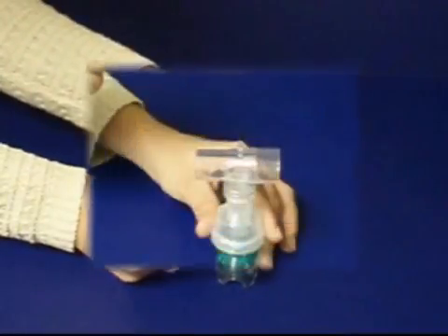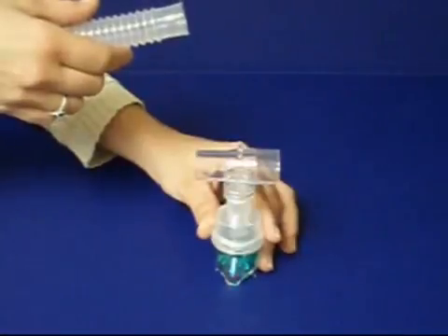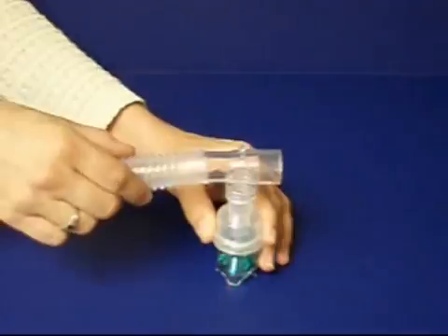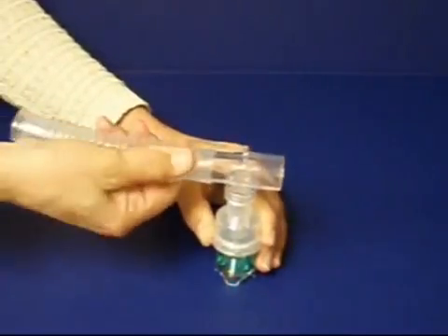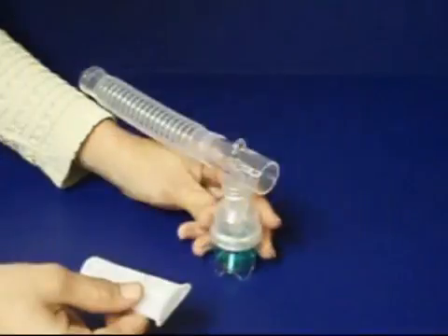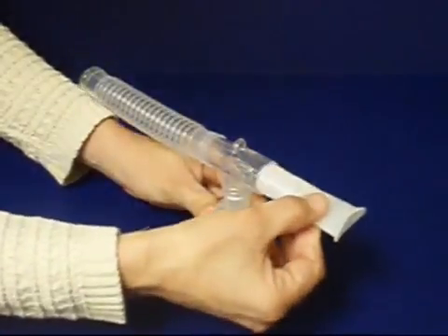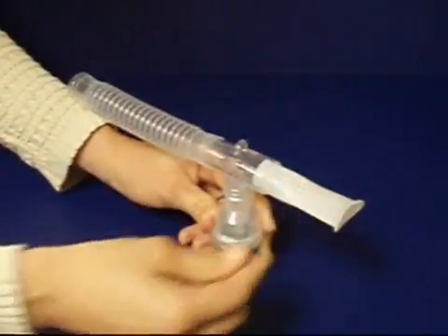Connect one end of the 6-inch corrugated tube over the smaller diameter end of the T adapter. This tube stores excess aerosolized medication between inhalations to minimize medication waste and to improve the effectiveness of your treatment. Place the round end of the mouthpiece into the other end of the T adapter.